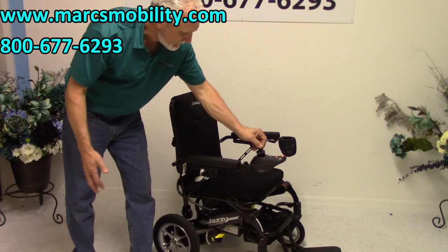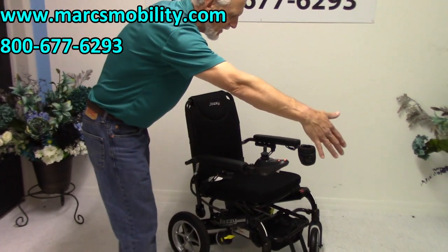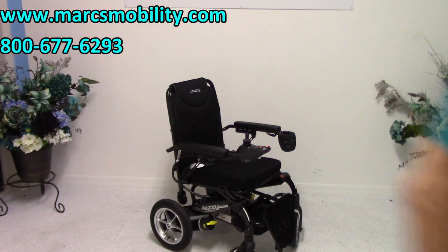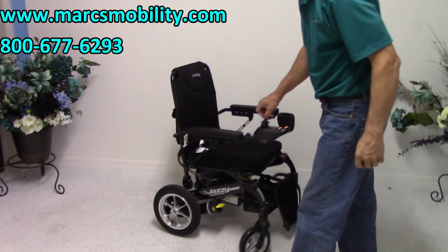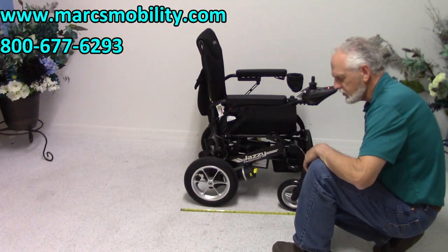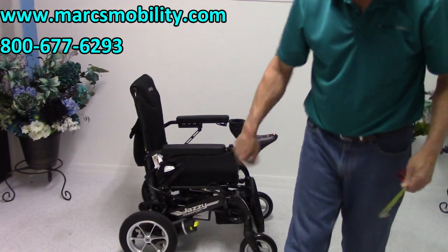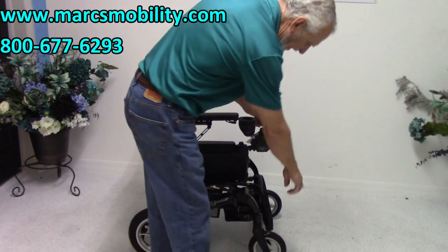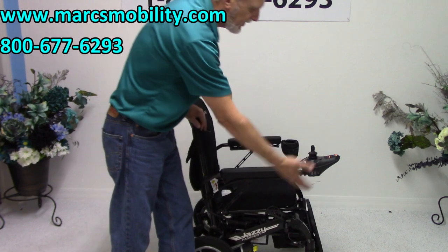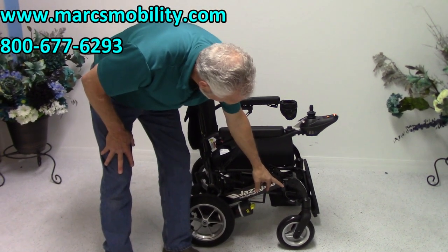The width of this chair is 23 and a half inches — under 24 inches. The length of the power chair is 40 inches from back to front. With the foot plate folded up, you're down to about 33 inches in length, which is better for fitting in a small car. The ground clearance is three inches below the motors. There is also some suspension on the front two forks, though it's subtle.